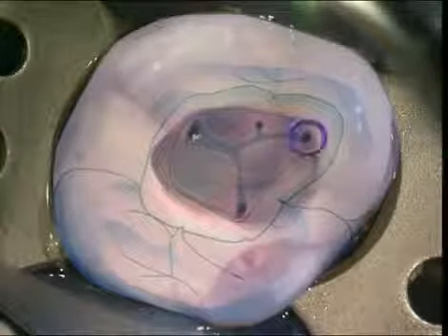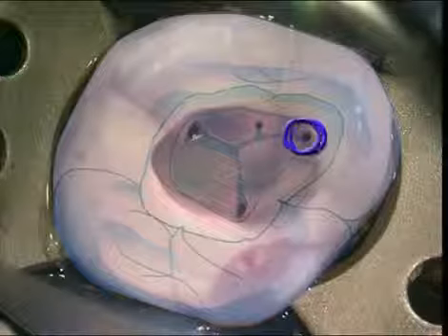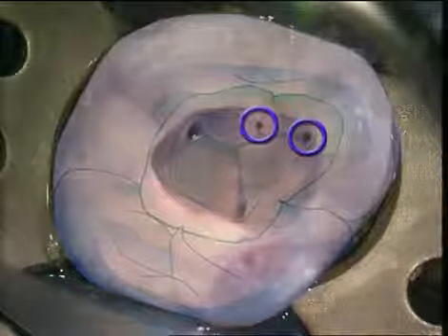In order to get a straight line access to the mesiobuccal root canal system, the walls of the access cavity should be inclined slightly towards the buccal and the mesial. In upper molars, the typical outline of the access cavity looks rhomboidal. Studies have shown that the mesiobuccal root manifested two root canal systems approximately 90% of the time. By carefully removing the secondary dentin towards the palatal side of the mesiobuccal orifice, an MB2 system can often be found with the endodontic explorer.